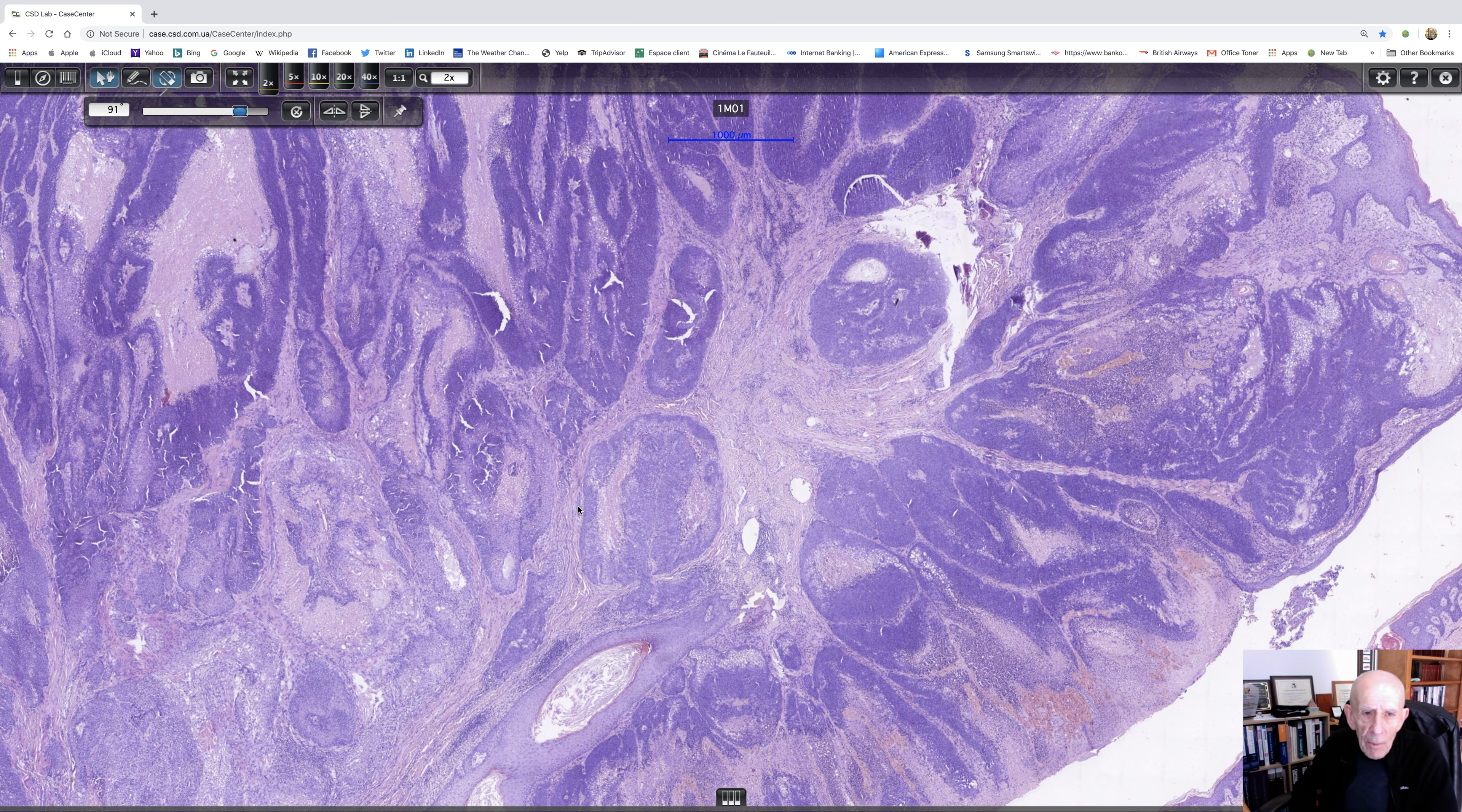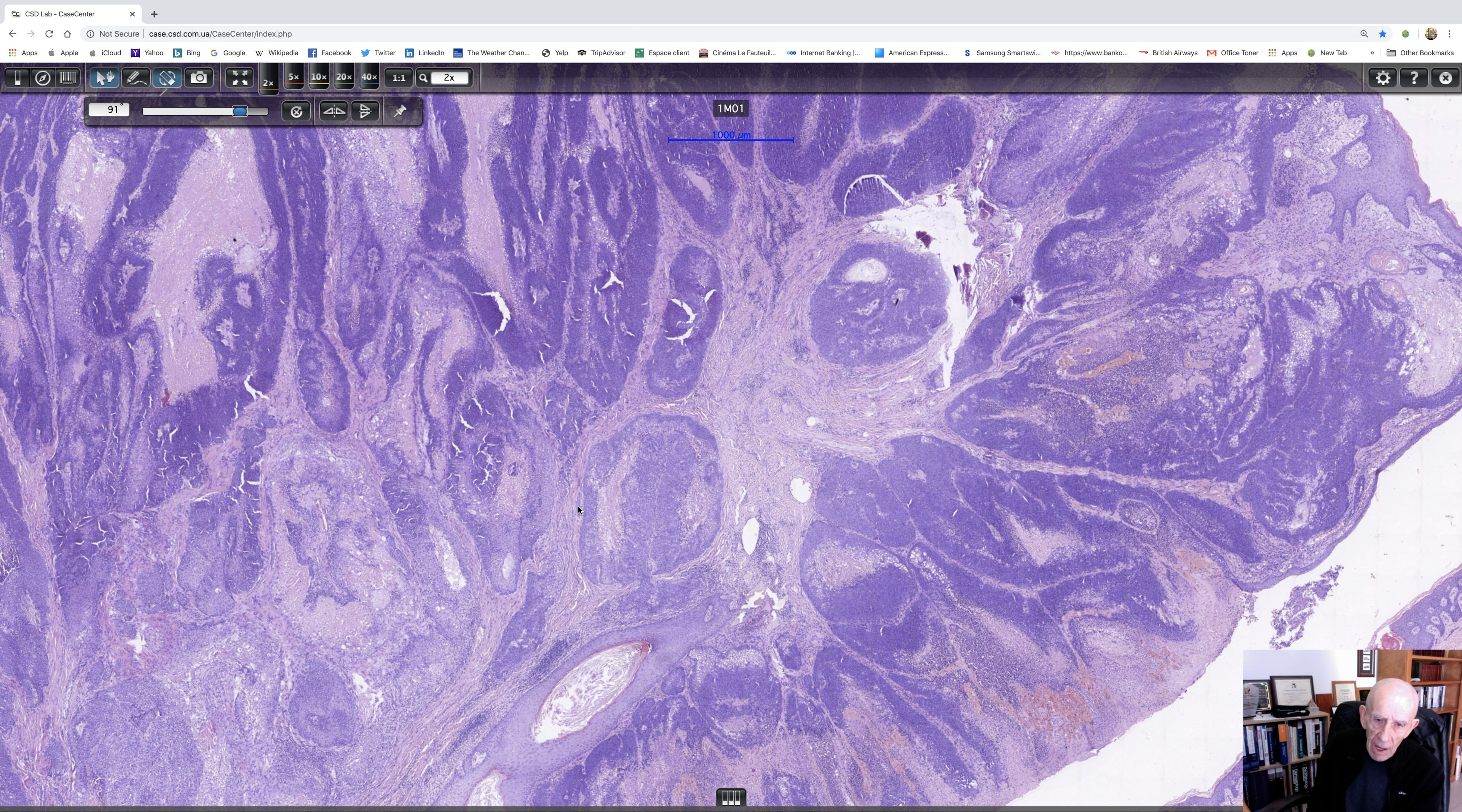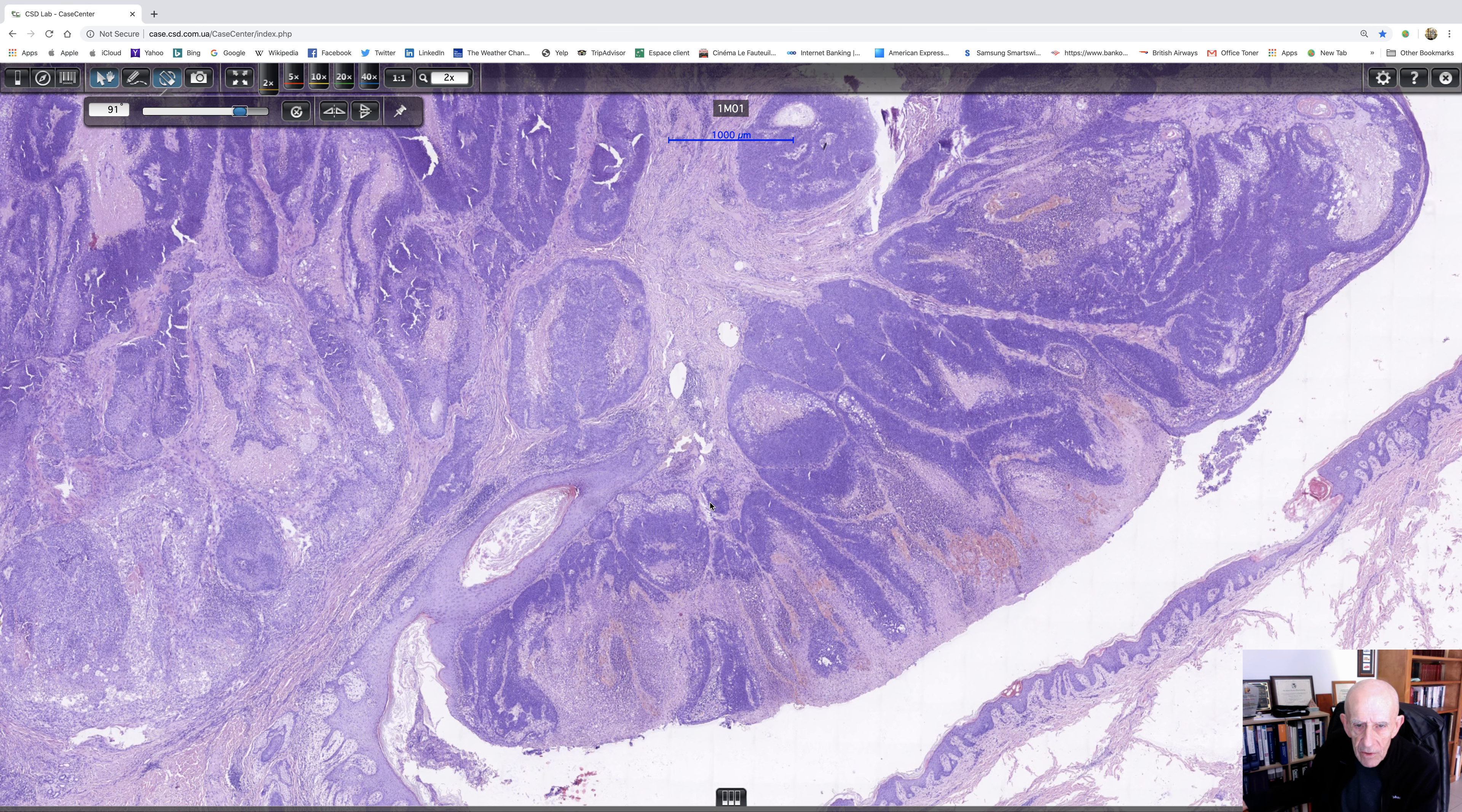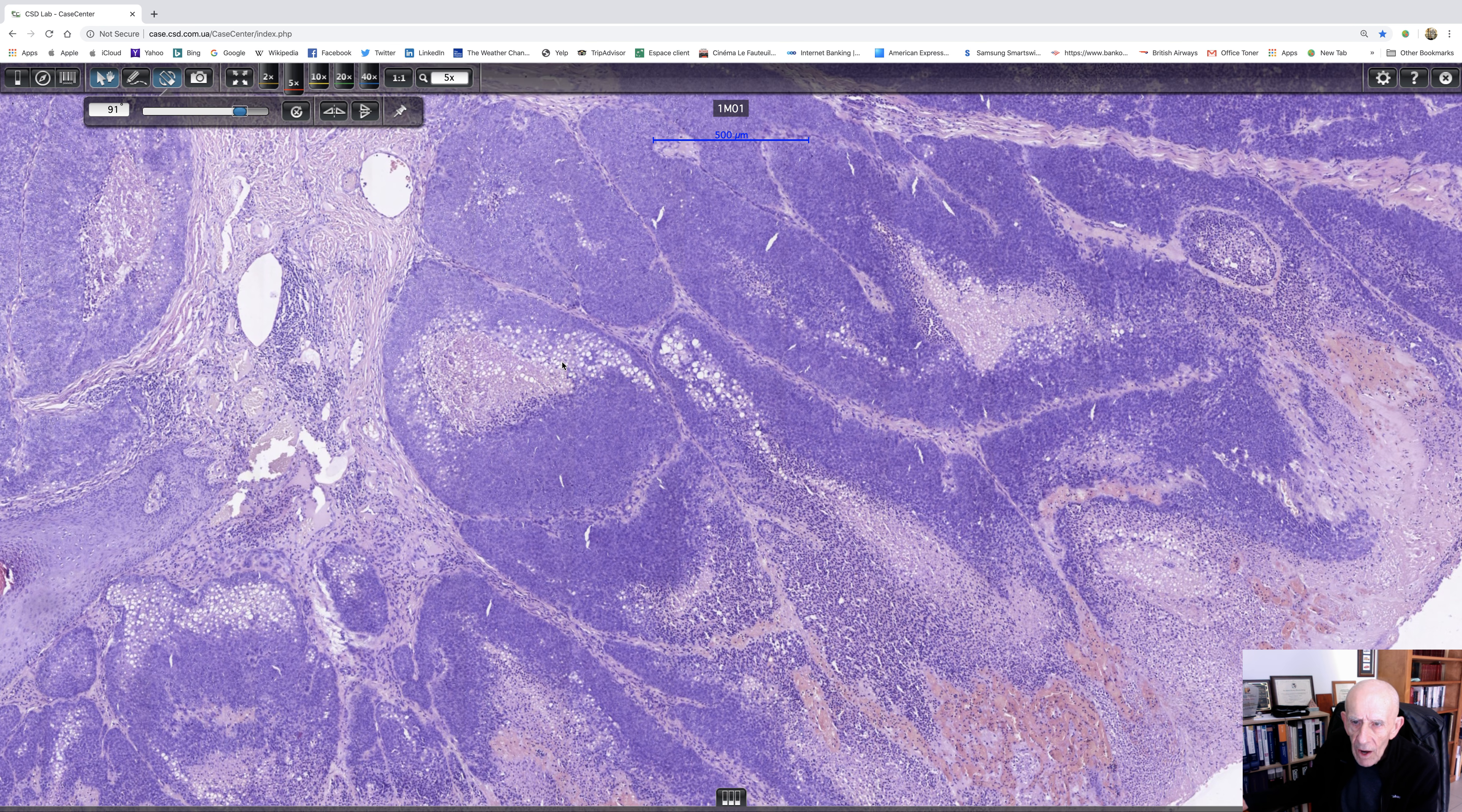Well, the commonest basaloid tumor is going to be a basal cell carcinoma. Then we could think of a trichoblastoma. That would be basaloid. A basaloid squam, I suppose, is possible. Sebaceous carcinoma is possible.